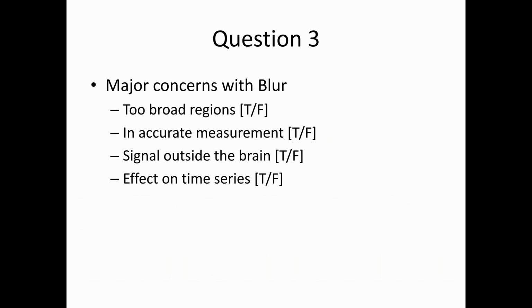What I was really picking up in one of the main things is inaccurate measurement, and probably the reason why this one was confusing is inaccurate measurement is such a global, vast term that it could mean anything. You're going to get false positives if you're not paying attention to the effects of your blur and what your blur is in your actual data. Then you're going to assume a characteristic of your noise, assume a characteristic of your blur, and you're not going to effectively threshold your data in light of what the actual inherent noise of your data is. Does that make sense? Yeah.